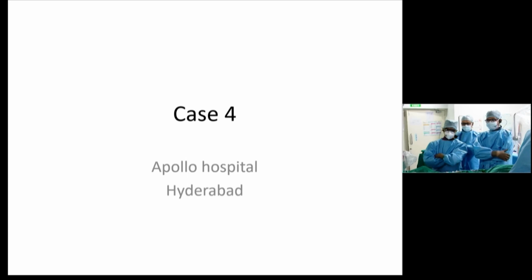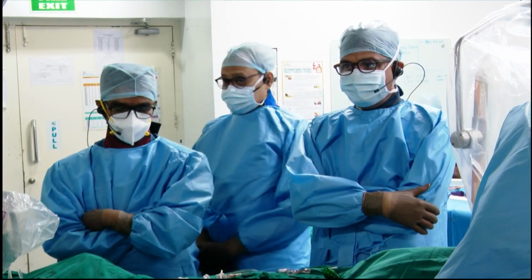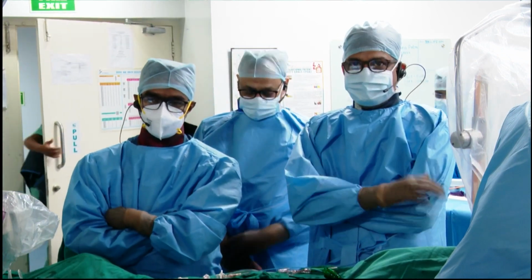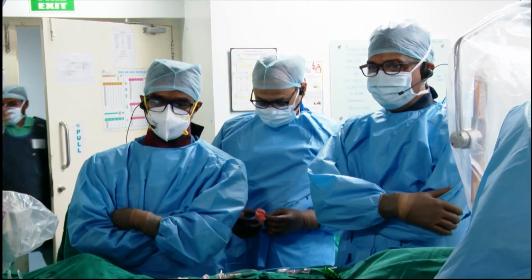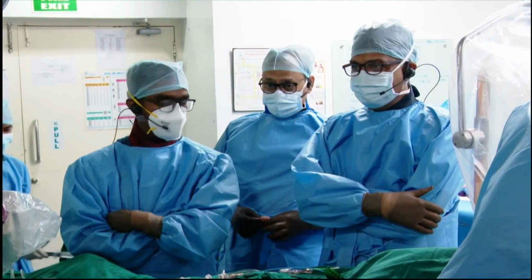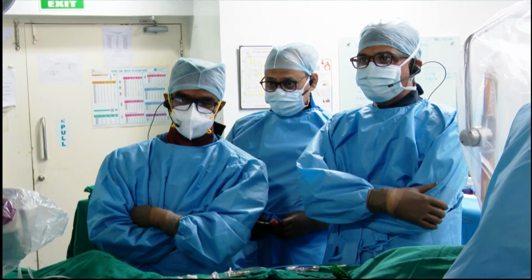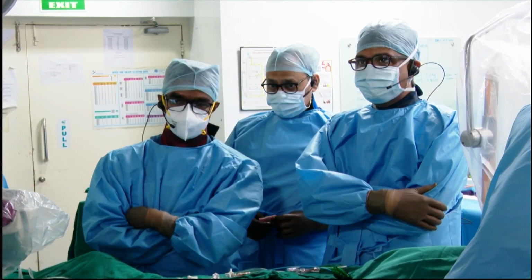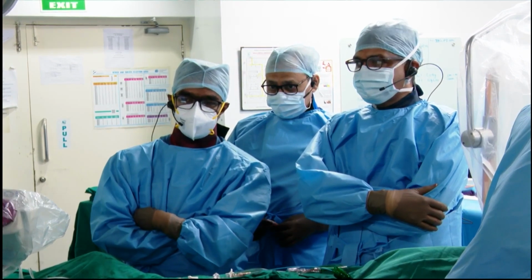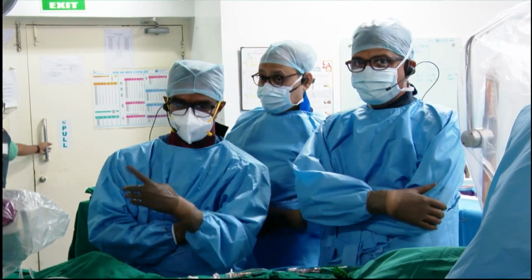Good morning, Karan Sitaram, and good morning, chairpersons. I think the first case of the second day, and this case being done in Apollo, Hyderabad. Operator is Dr. Ramesh, and Dr. Manoj Agrawal and Dr. Rufus will introduce the case. This is simultaneous transmission from Medant, Praveen Chandra is doing. So you can alternate. This is a complex case with a small annulus, low coronary, and a really tricky case. I will see how Dr. Ramesh is handling this case. Over to you.